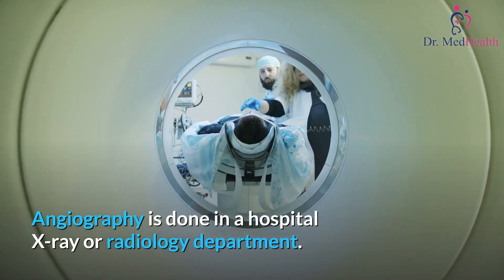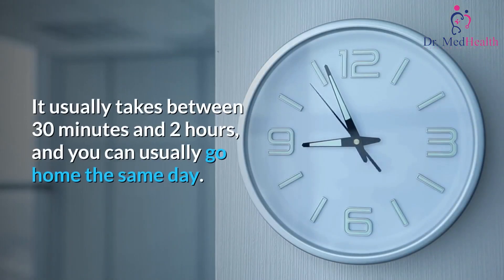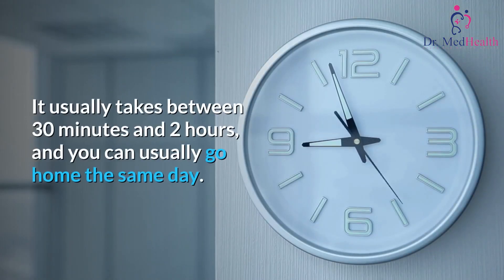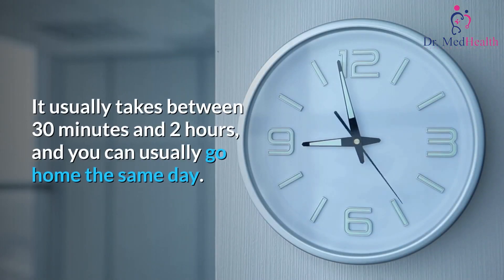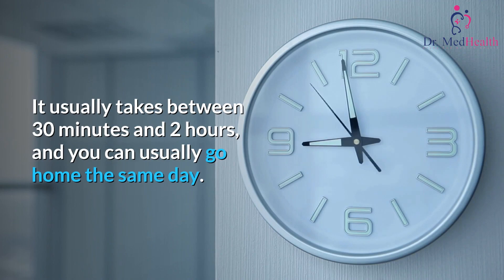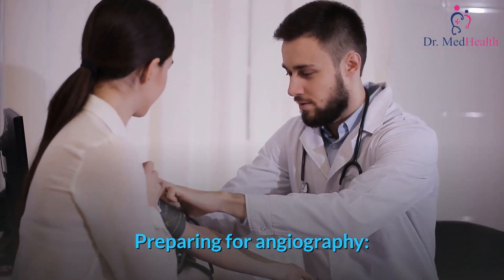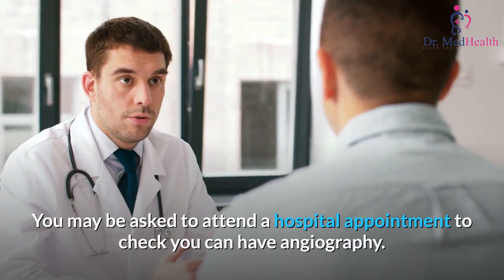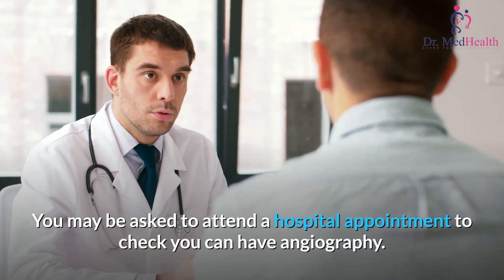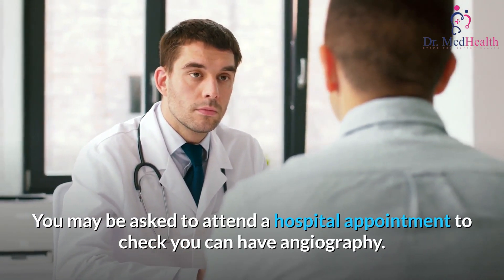Angiography is done in a hospital x-ray or radiology department. It usually takes between 30 minutes and two hours, and you can usually go home the same day.